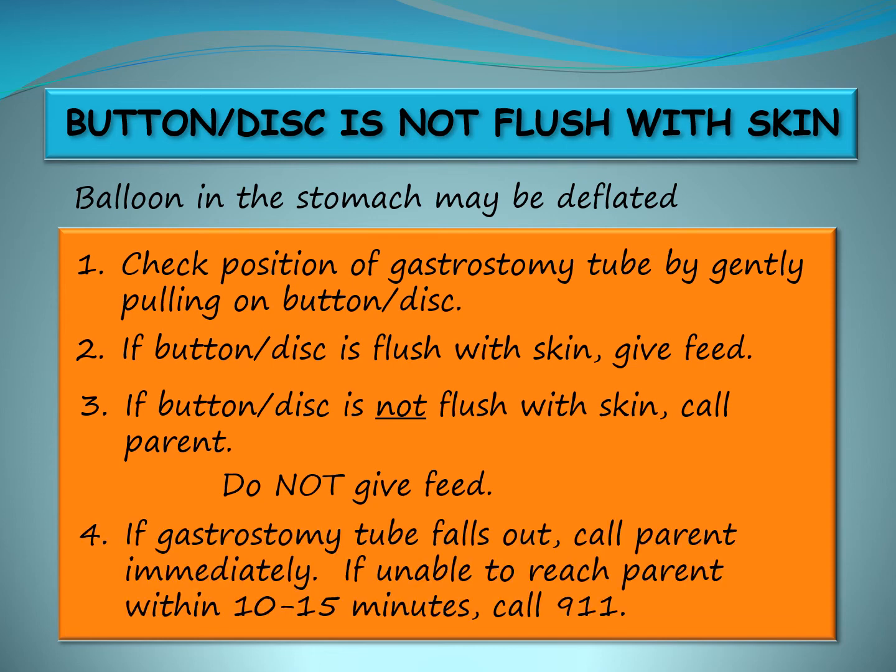If the gastrostomy tube falls out of the stoma, contact the parent immediately. If you cannot reach the parent within 10 to 15 minutes, call 911.